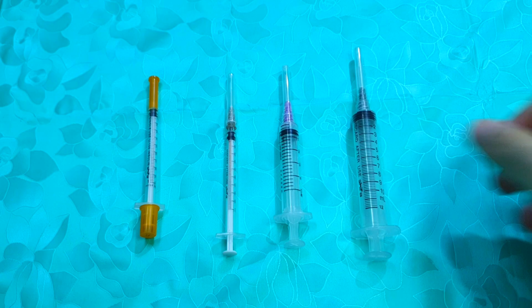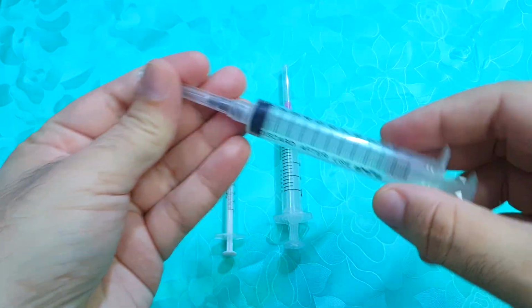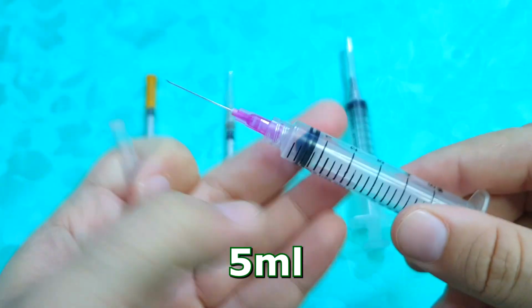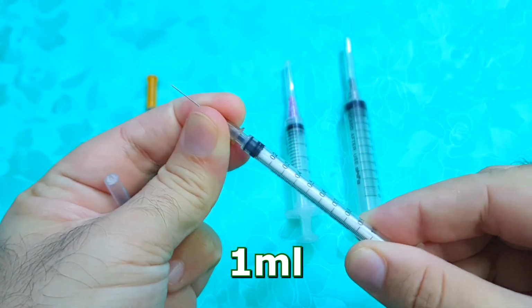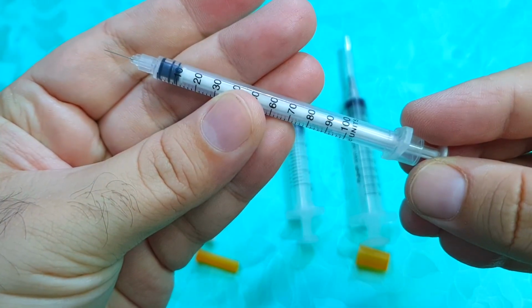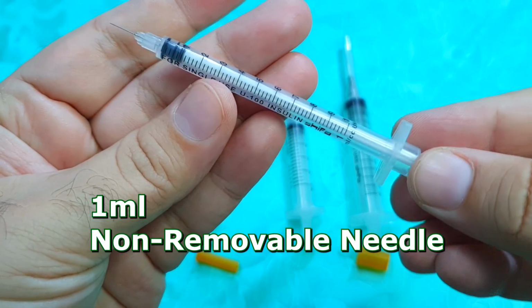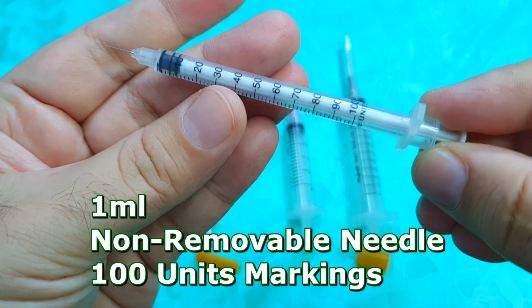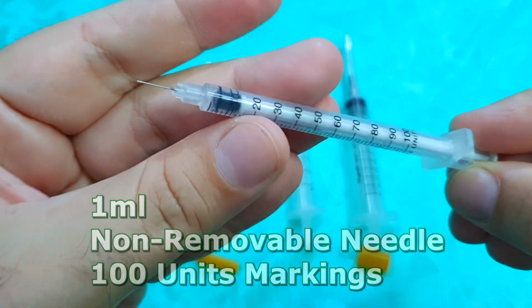You can see different types of syringes here. Starting from the right side, first one is a 10 ml syringe, the second one is a 5 ml syringe, the third one is a 1 ml syringe, the fourth one is also 1 ml syringe, but its needle is non-removable. It is also marked up to 100 units as this is the most commonly used syringe to administer insulin in the fat under the skin.